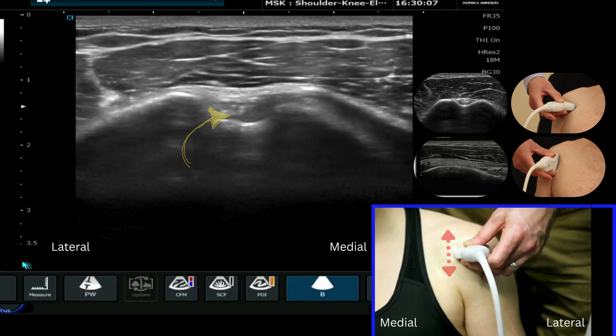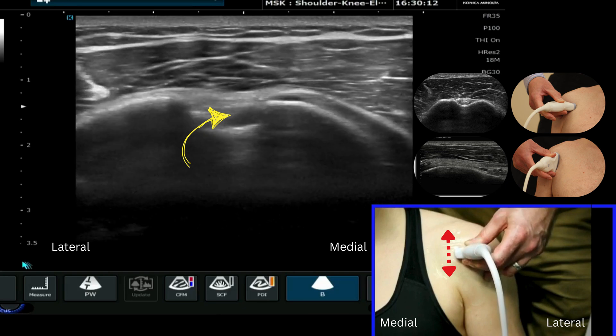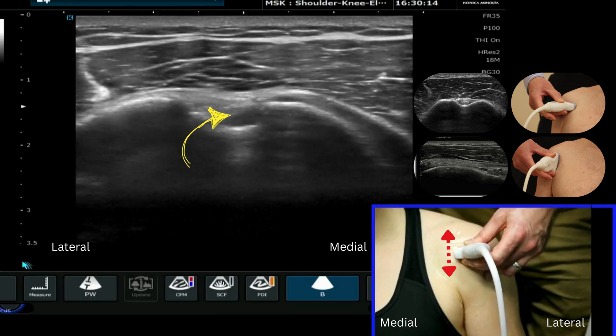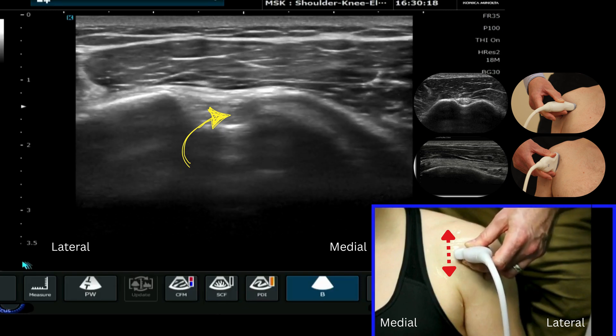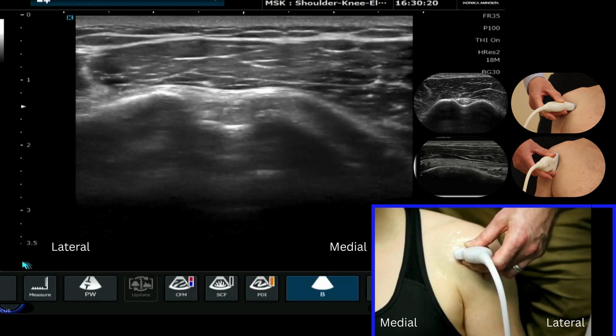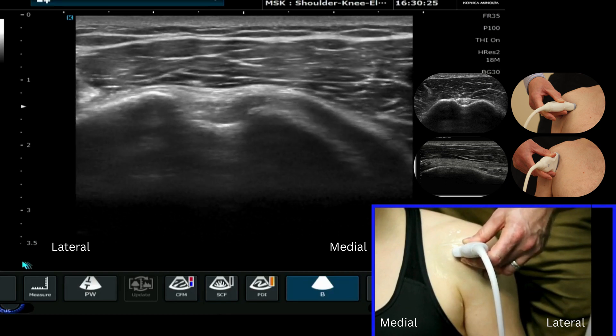Here's my long head of biceps now. If I tilt the probe, I want to make the long head of biceps as bright as possible. You can see it will go dark and bright very quickly on relatively small movements of the probe, and this is due to anisotropy because the long head of biceps tendon is quite reflective.